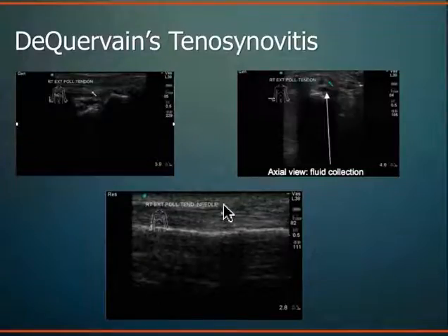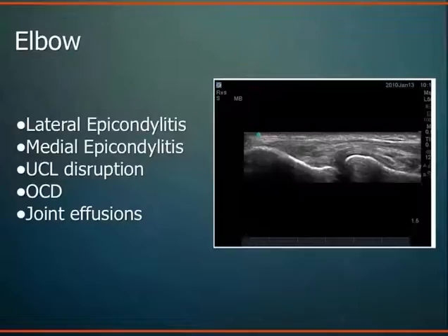You can see the tendon sheath, and then you can see your needle slip into that tendon sheath and see infiltration of the fluid around the tendon itself. Also nice to ensure that you're not actually in the tendon. Intratendinous injections are contraindicated, especially if you're talking about cortisone. Certain modalities you're actually trying to target the tendon itself, but in general, you're trying to get that medicine around the tendon, but not actually in the tendon. And you can see that quite nicely when you're using ultrasound guidance. It can be quite helpful.